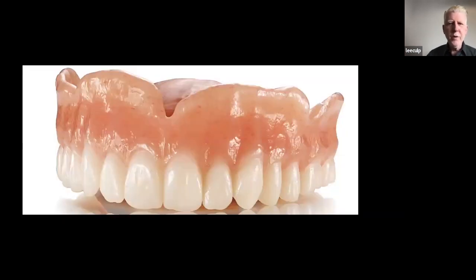So what you're looking at, when we started doing this, we started milling the denture teeth, and we had to figure out some ways to get it done. But what you're looking at is a denture base that is one piece, the pink, that is milled out. The teeth are a bridge of teeth that we milled out. So they're not individual teeth, they are milled teeth in one big 12-unit bridge that fits into the base like a puzzle piece.